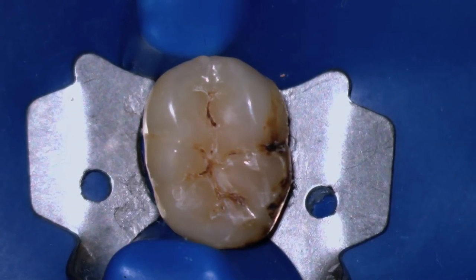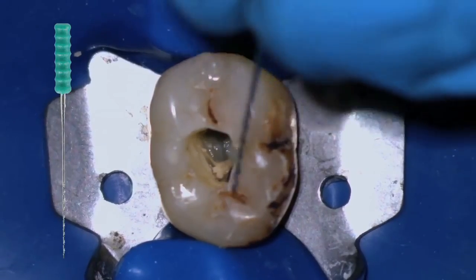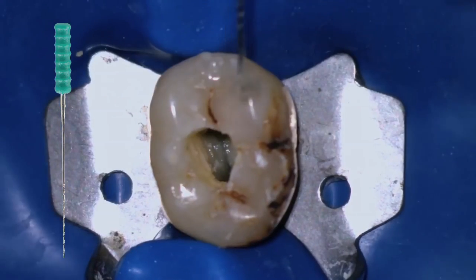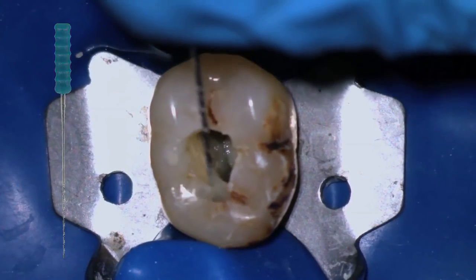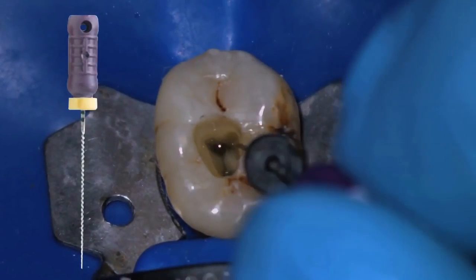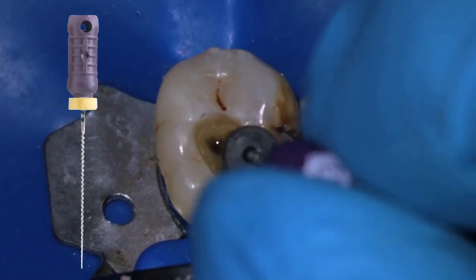Here we have the tooth that has been ascertained to require root canal therapy and is restorable. We do the access opening. After our access opening, we remove the contents of the pulp chamber, in this case with an instrument. We ascertain that the canals are patent with a very small file. You can see the fluids in the very flooded pulp chamber.